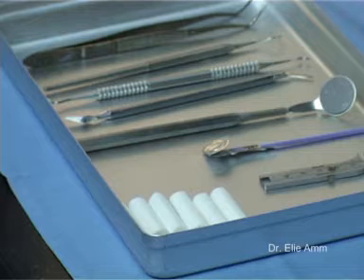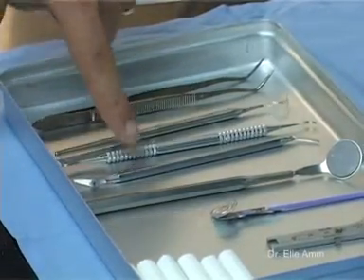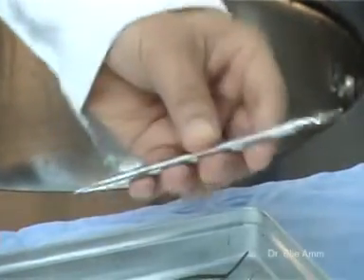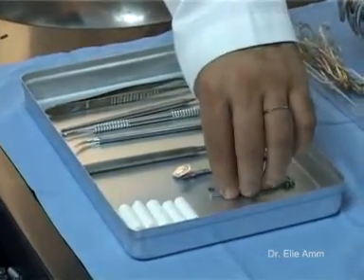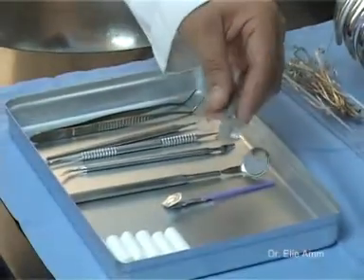The material needed is the same as for labial bonding, with some minor modifications according to the clinician's preferences. Specifically: a regular tweezer, probe, scaler, the lingual spatula from Forestadent to open and close the wings of 2D lingual brackets, intra-oral mirror, self-etching primer, the special Bollet gauge from Forestadent to get precise height measurements, and cotton rolls.